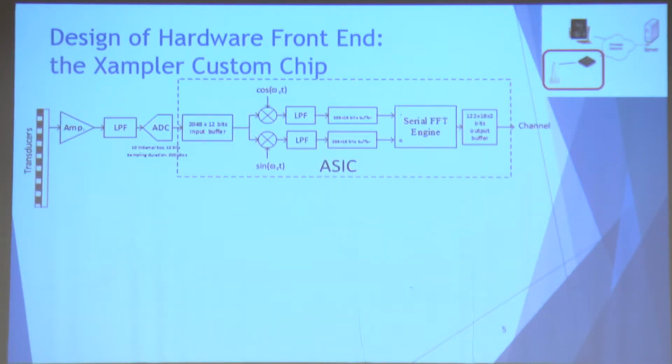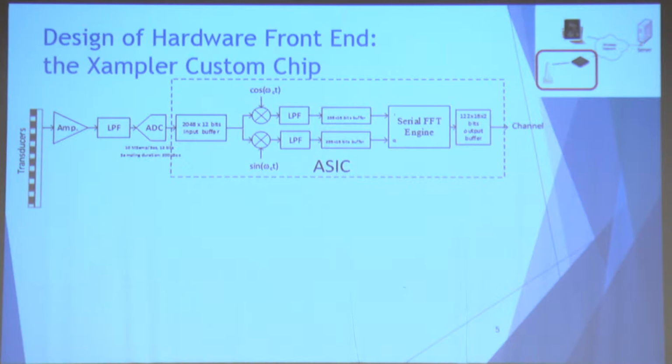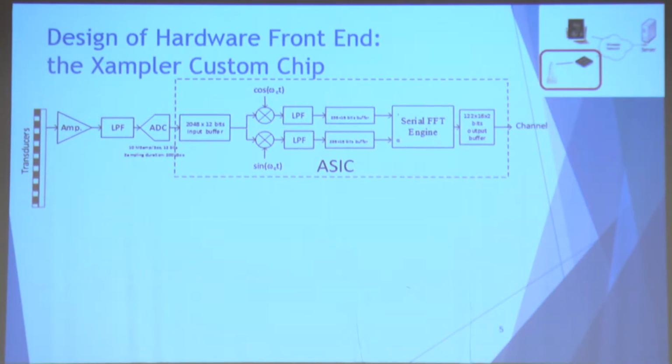Now, we have the design of the hardware for the front end in order to demonstrate that it is feasible, that it's not only theory, but we can make it a real instrument that is used by doctors. So what you see is what we have in the ASIC that we asked the assistants of the VLSI laboratory to design. This chip will be inside the ultrasonic probe, and it is doing demodulation, decimation, and passing the samples to the frequency domain, and then a subset of these frequency domain samples are transmitted over a channel.